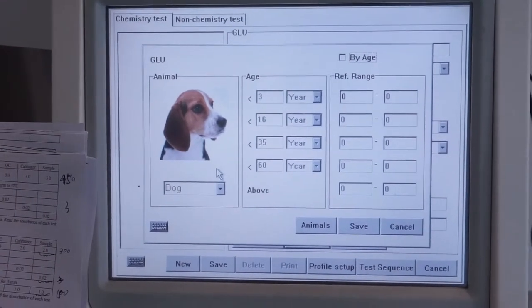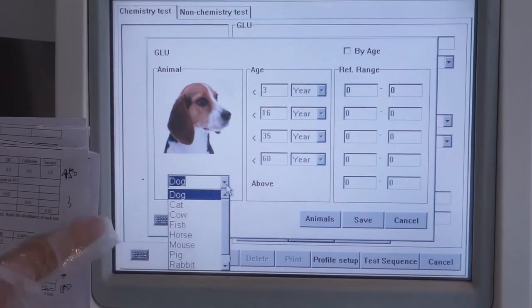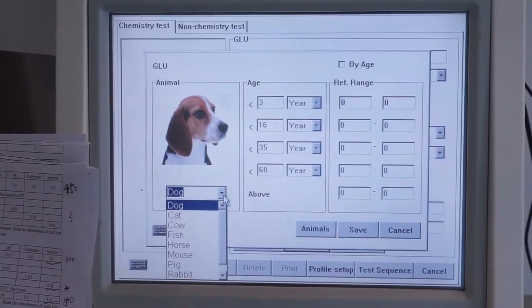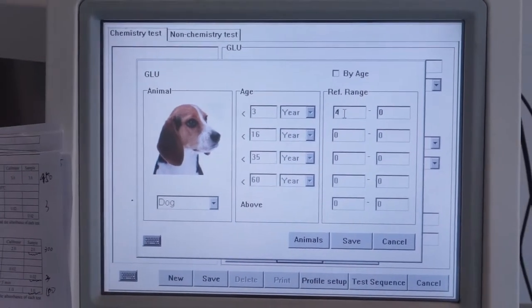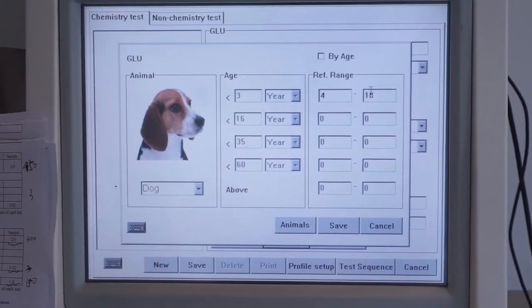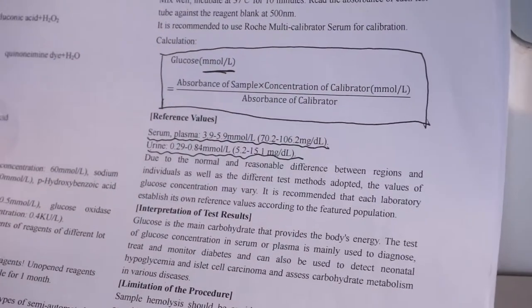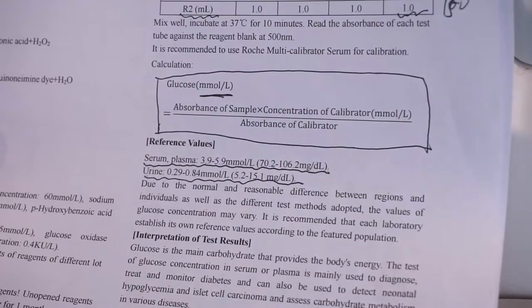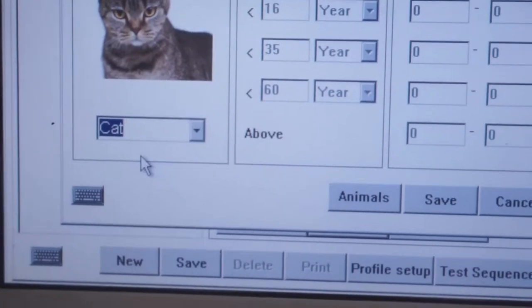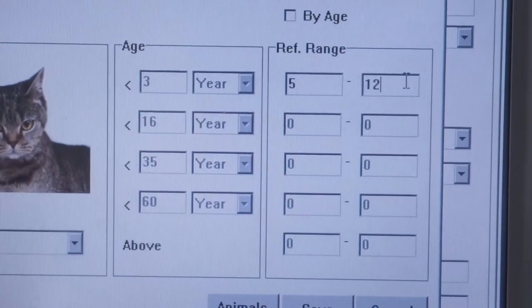Okay, and after inputting the cuvette, we go to the parameter to input each item. Now I take an example: we take glucose, AST and UREA, the three items, just as an example to teach you how to input the parameters. Okay, and then we input the parameter and we click new, and follow the number one instruction, which is glucose. Input the name, and then click OK. And the full name is glucose. In the unit, you can see the formula. The unit is showing here, glucose unit.